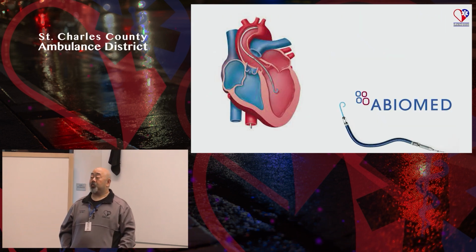Has any of you transported one before? A couple, three? Okay. So Impella is really a nifty gadget because unlike an LVAD, that needs a heart surgeon, sometimes a vascular surgeon, sometimes a thoracic surgeon, sometimes all three, and it's really done at only certain centers, like there is only one LVAD center in the region at Barnes. An Impella can be placed by anyone that knows how to do central line placements, essentially, through Seldinger technique.